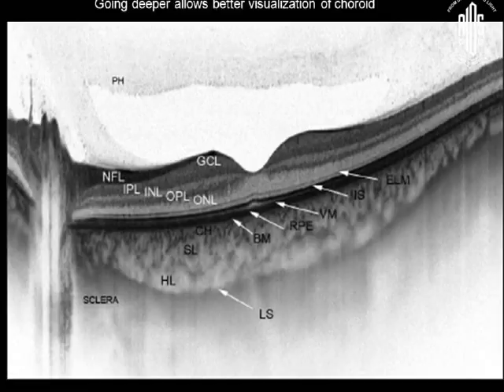Another good thing which swept source is teaching us more and more about is the precortical pocket. This pocket is a kind of reservoir. Sometimes so many mediators of inflammation collect within this pocket that if your intravitreal injection is reaching somewhere else and is not accessible to this pocket, you will not have a good response.